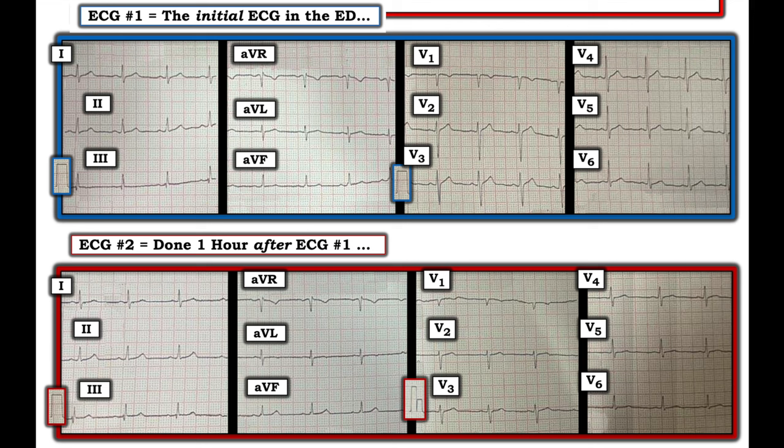Here, if troponin was up, the provider may say, gee, that was an NSTEMI because we don't see the ST elevation. When in fact, if the troponin is up, and here you had chest pain, and here the chest pain was relieved, that was an OMI. And if you're there, that patient needs to go to cath. And ideally, repeating the cardiogram should have been done a lot sooner.